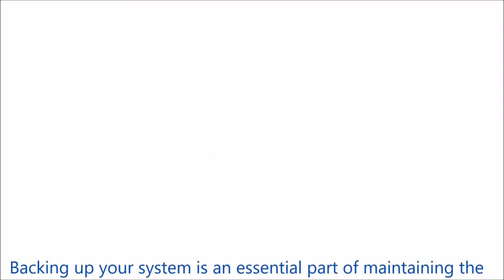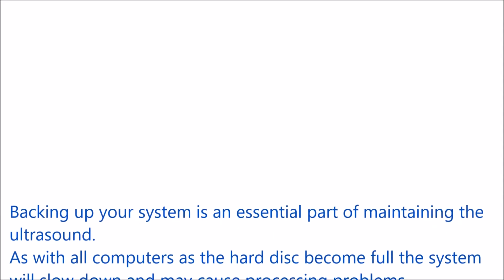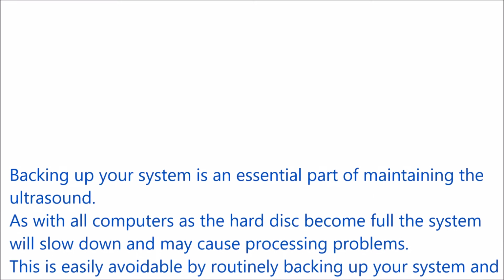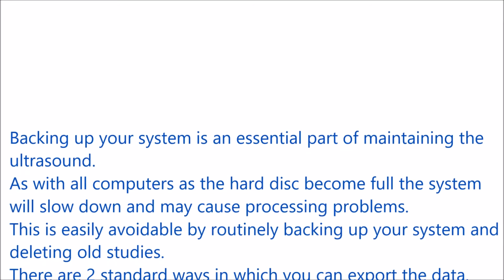Backing up your system is an essential part of maintaining the ultrasound. As with all computers, as the hard disk becomes full, the system will slow down and may cause processing problems. This is easily avoidable though by routinely backing up the system and deleting any old studies.